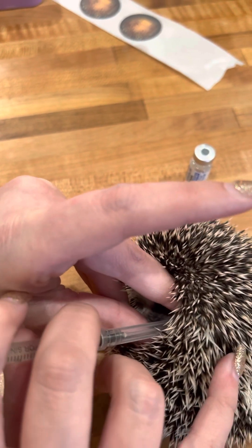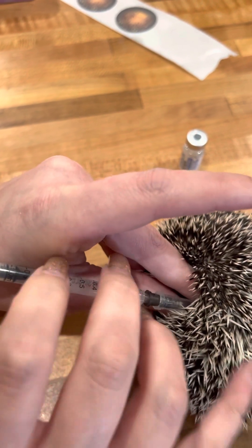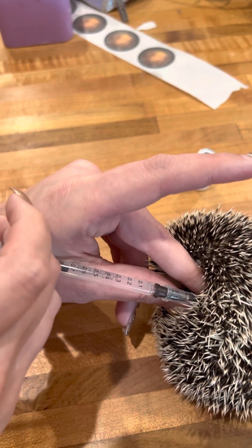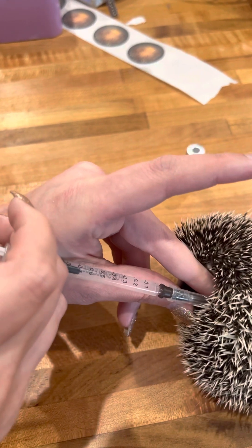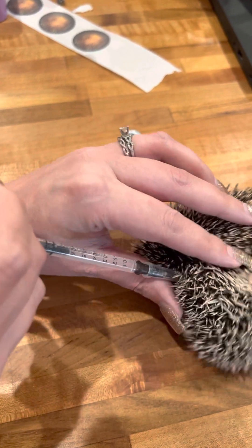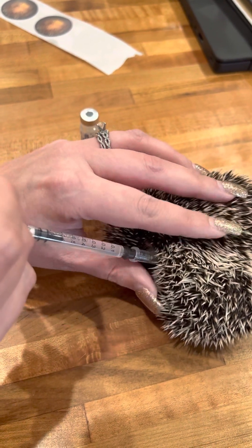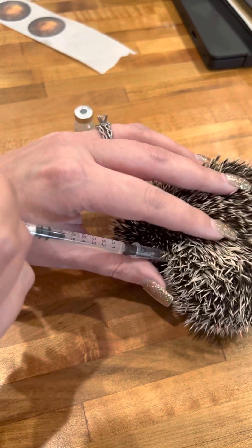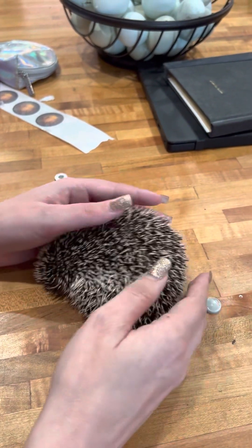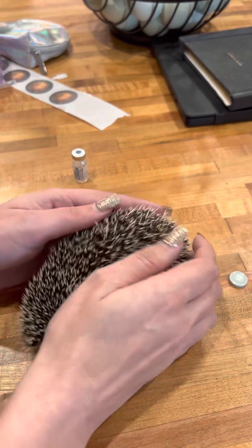While you're in there, you're going to push and slowly inject the entire thing. You can pull like this while you're injecting around the site because it does make it less painful for them. Once you're done, give them a nice treat and they're done.